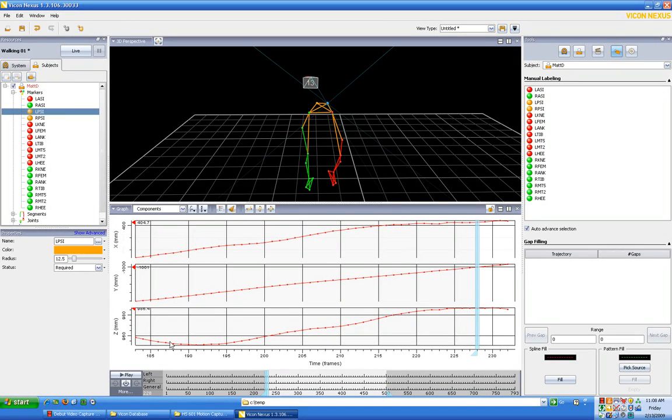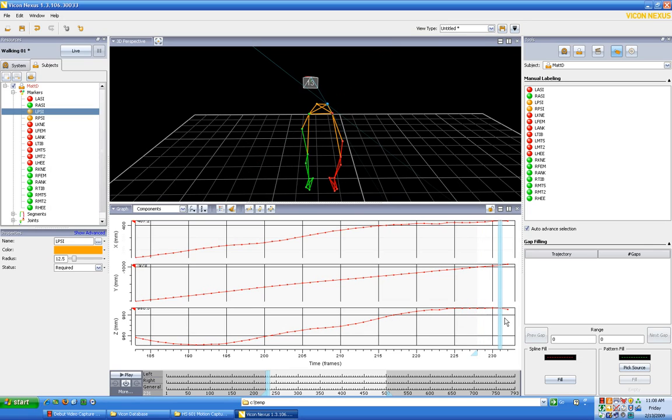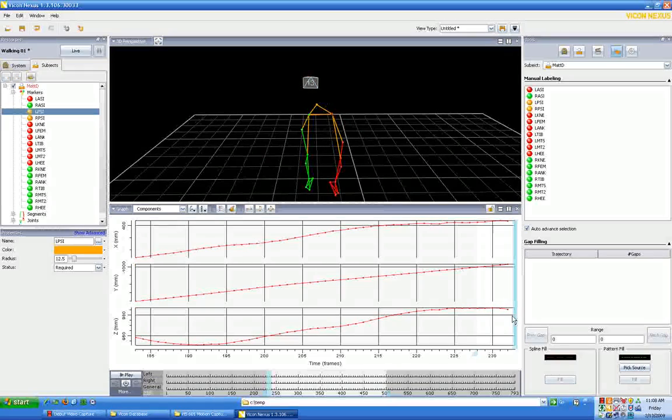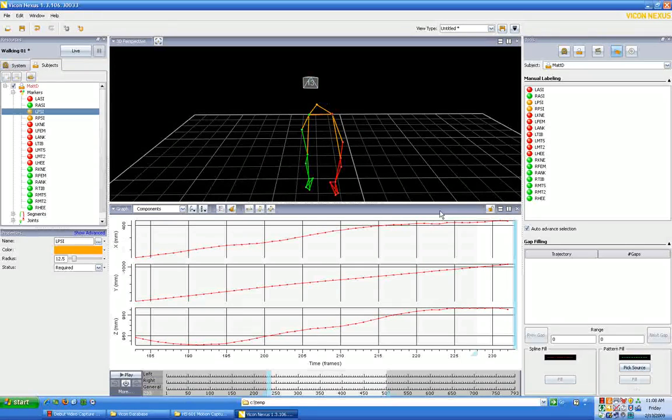This is just showing where there is a dot and then the line is just the interpolation from dot to dot or frame to frame of the video. Now if we notice, if we go ahead, then to the next one it's gone, right? But if we go ahead it's back, but it doesn't know that that's the dot.